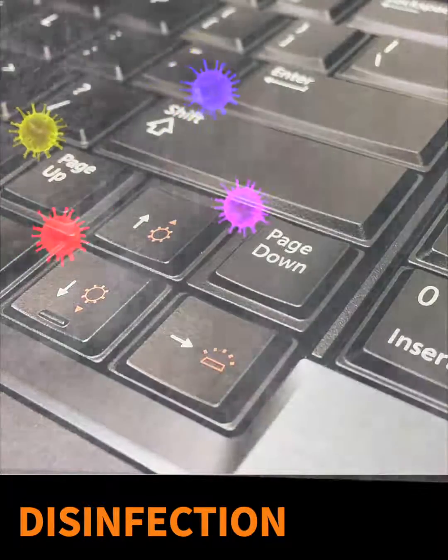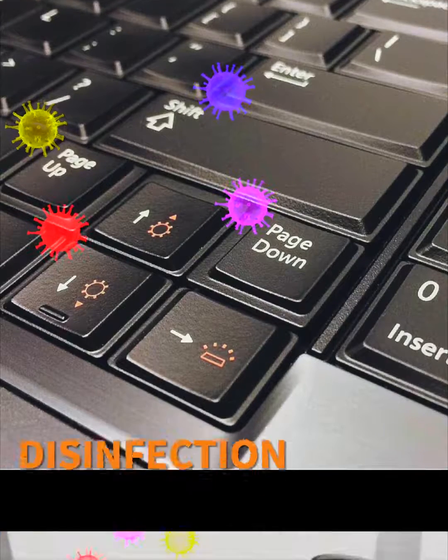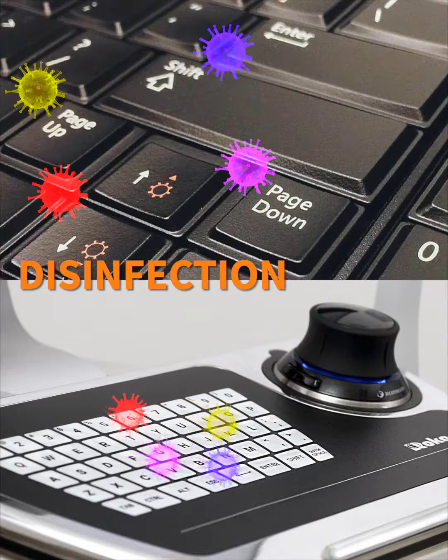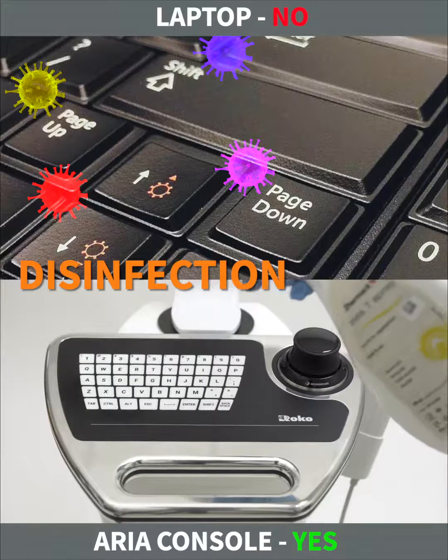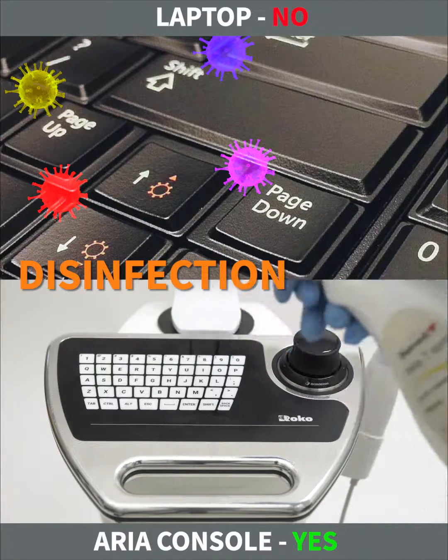Aerosol caused by tooth polishing is spread all over the lab. Bacteria sit on laptop keys and filter in grooves among them. Laptop keyboards cannot be disinfected. But membrane keyboards of the Aria console can be cleaned and disinfected without any limits.